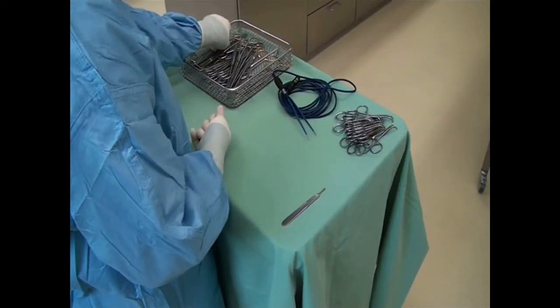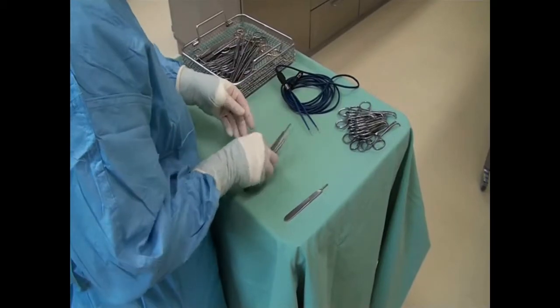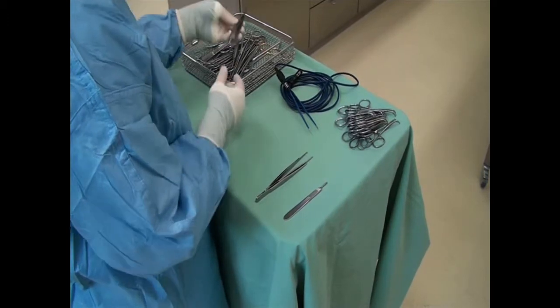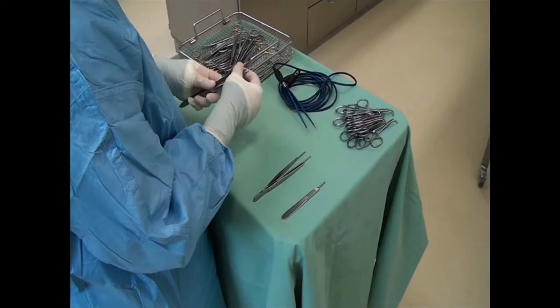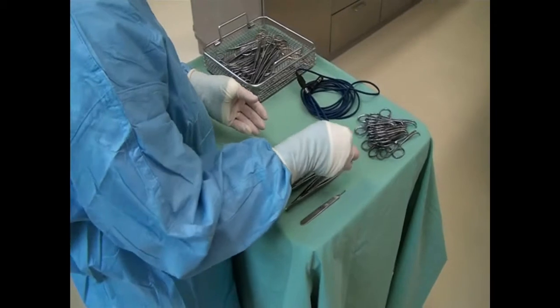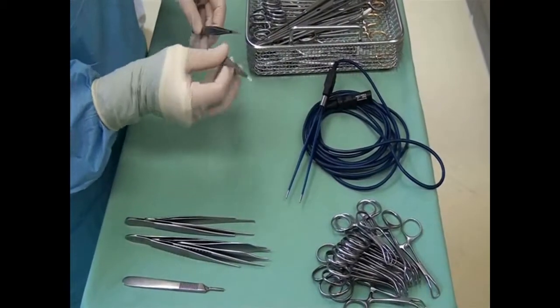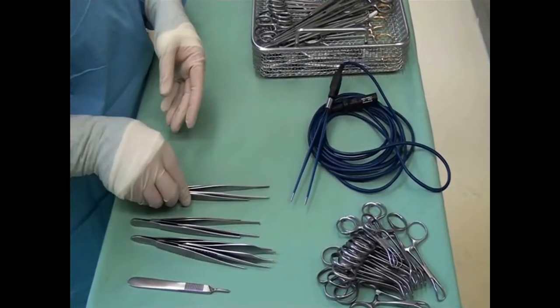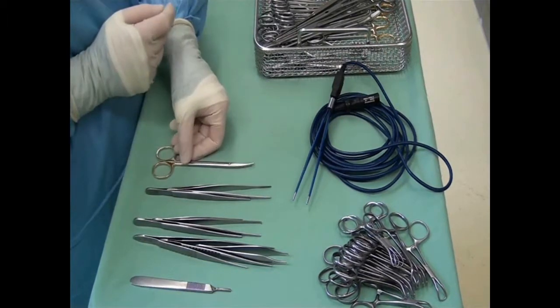Then arrange the instruments in the order they will be used during surgery. Then the different scissors are laid out.